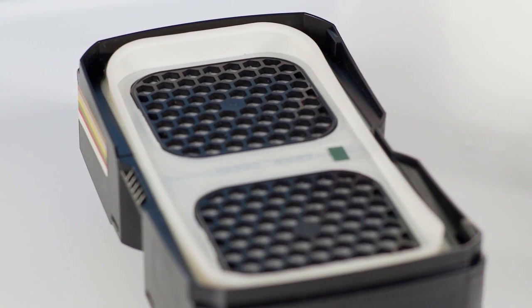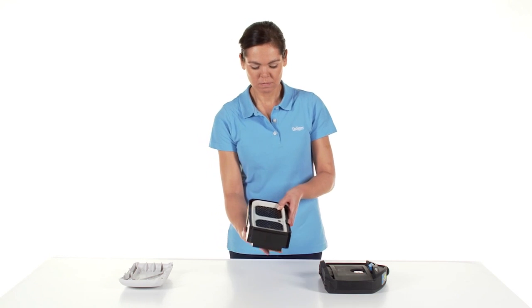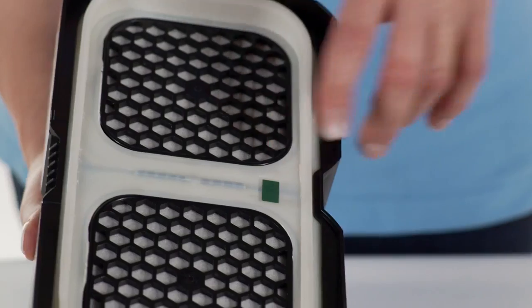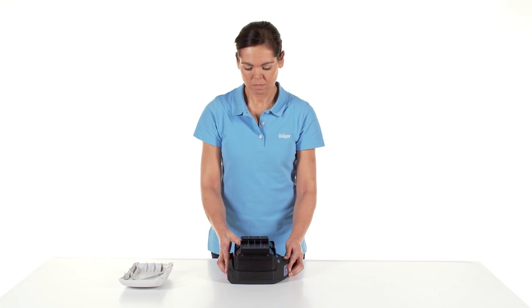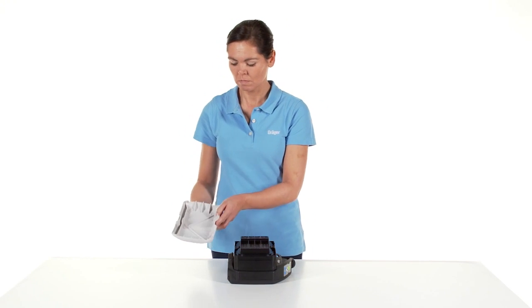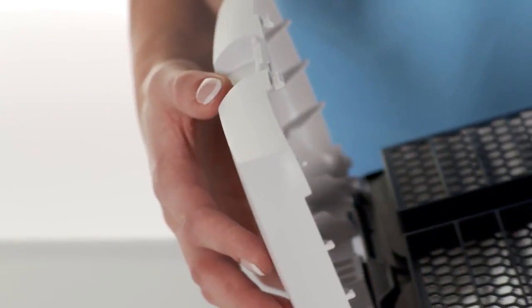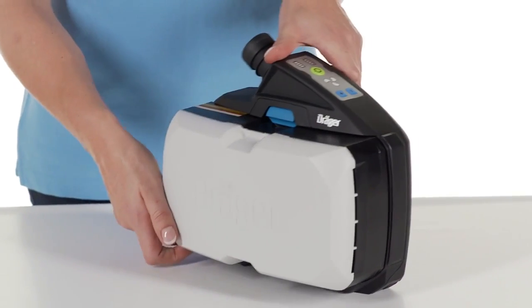If you use a gas or combination filter, insert the filter at an angle into the unit. The color marking on the inside of the gas or combination filter points downwards towards the device. Slip the splash guard lid over it. When correctly positioned, the lid snaps into place with an audible click.